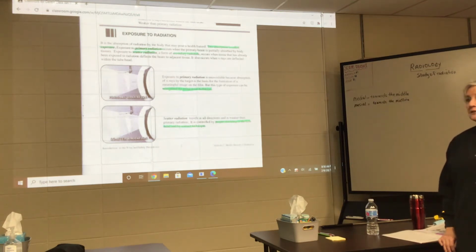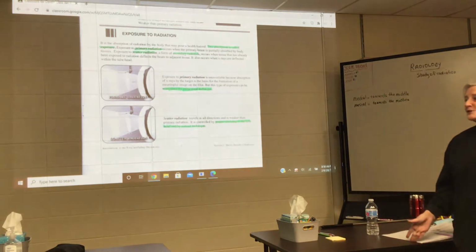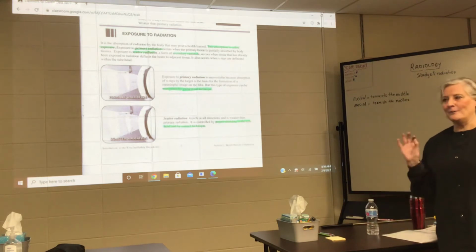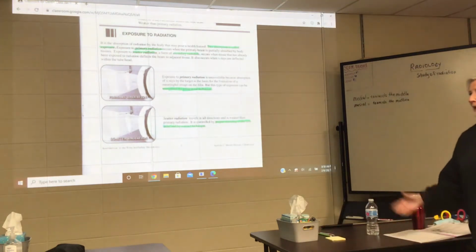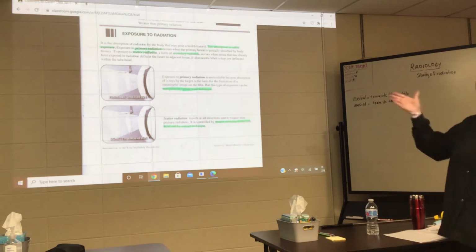A, they don't have any place to store them. B, the actual X-rays, films, radiographs should never leave the practice. They are part of that practice. They should send a copy. And if they duplicate it, they don't duplicate them one by one. They usually put it out like a full mouth and duplicate it, so you get like a pano film with a bunch of PAs on it.